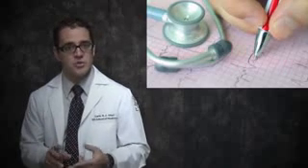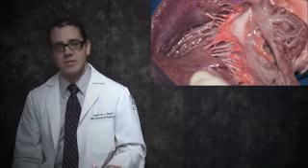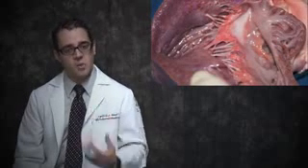If you had a heart attack that caused major heart damage. If you had an EKG, an electrocardiogram, stress test, or other tests with results that suggest heart disease. Cardiac catheterization also might be used if your doctor thinks you have a heart defect or if you're about to have heart surgery. The procedure shows the overall shape of your heart and the 4 large spaces or heart chambers inside of it. This inside view of the heart will show certain heart defects and help your doctor plan your heart surgery. Sometimes doctors use cardiac catheterization to see how well the heart valves are working.